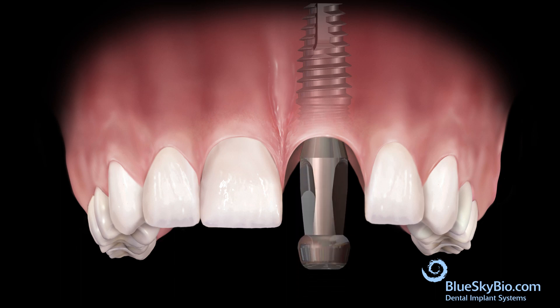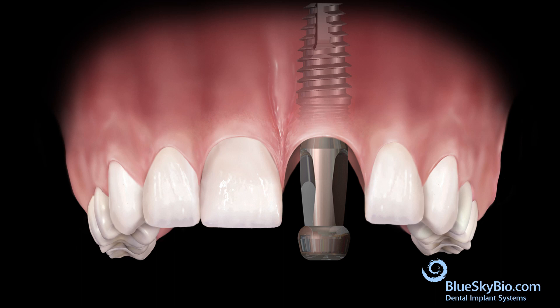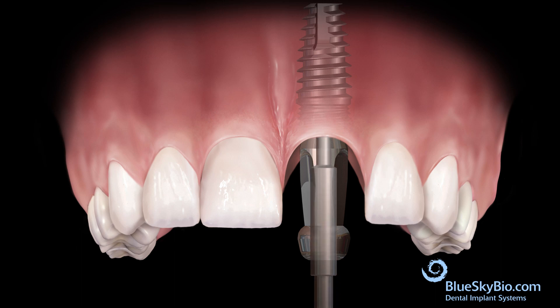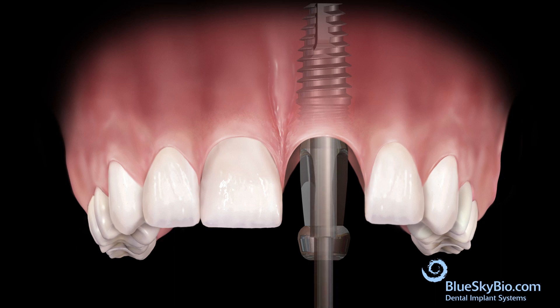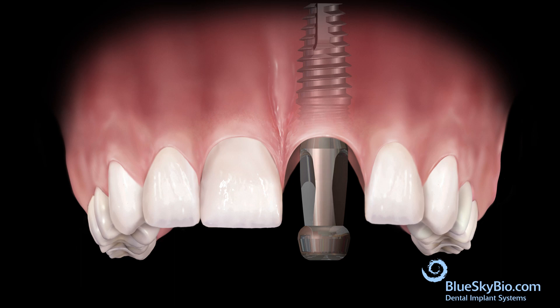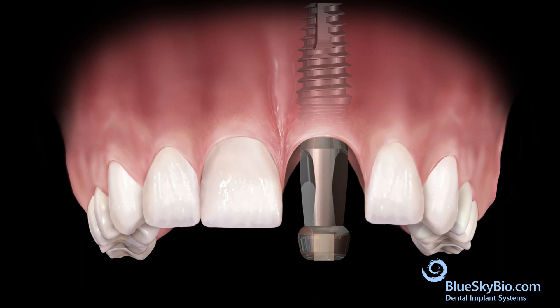Insert the impression transfer. It is important that the mating area of the impression transfer fully engages the mating area of the implant. Tighten the fixation screw only with finger pressure. Fill the top of the screw head with wax to prevent impression material from flowing into the head of the screw.